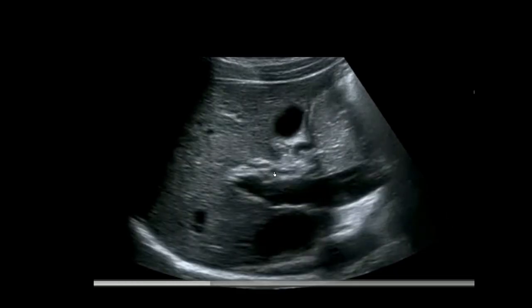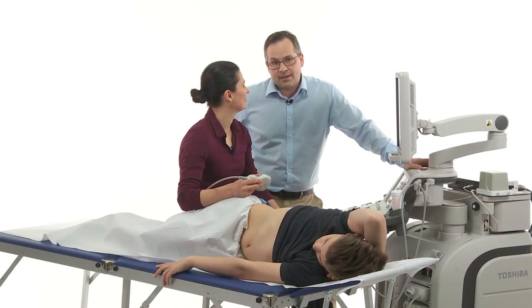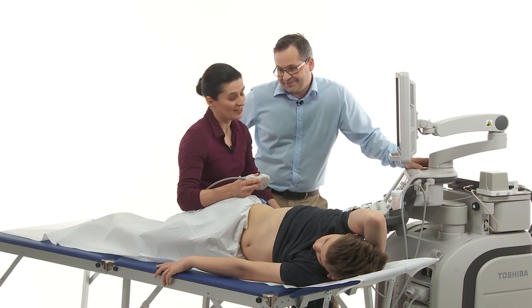So we also have the gallbladder in the view here, and the portal vein in the dorsal part of the picture, and the common bile duct, which is not so easy to see in this picture. I would take some color Doppler to identify it, and we will show this to you in our intercostal view. We have already seen branches of the portal vein and some intrahepatic bile ducts, but to detect the whole portal vein, we need another view. Can you show us? Yes, I'd like to.